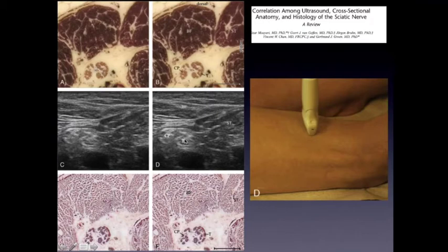They are divided, but interestingly we can start to depict an external fascial layer surrounding the nerve, which is not the epineurium, and which is called by many the paraneural fascia, which isolates the nerve from the muscles. And this is confirmed here, the two nerves and muscles, and this different compartment that we have here.